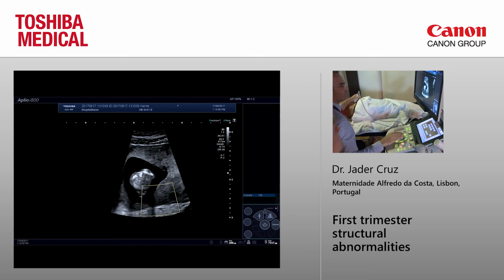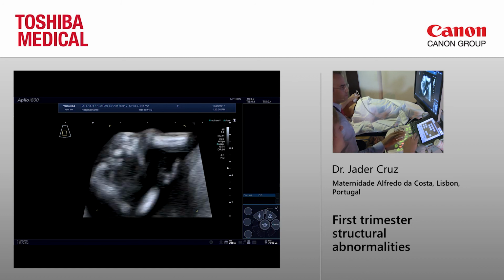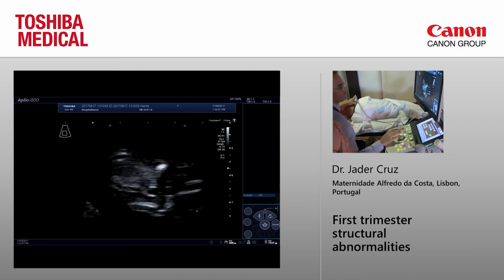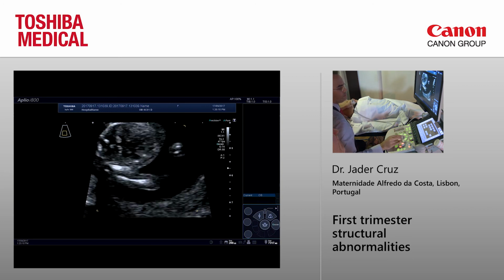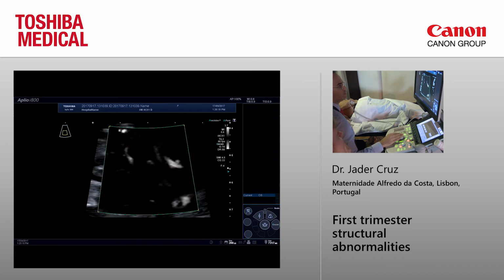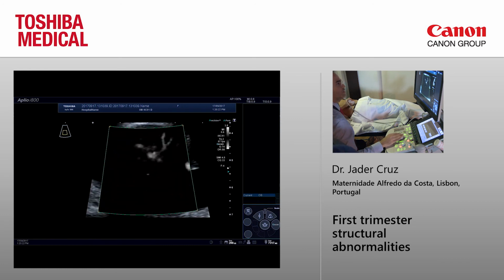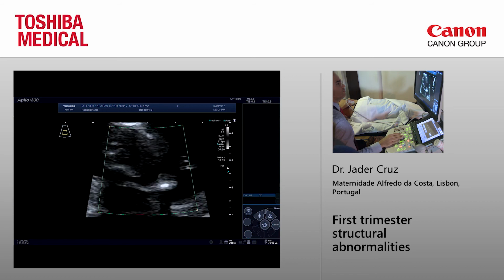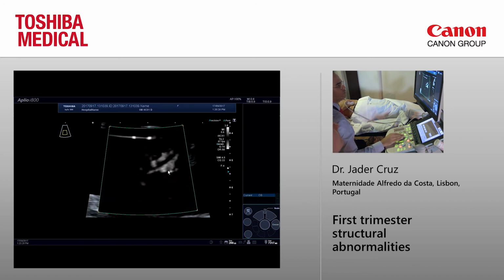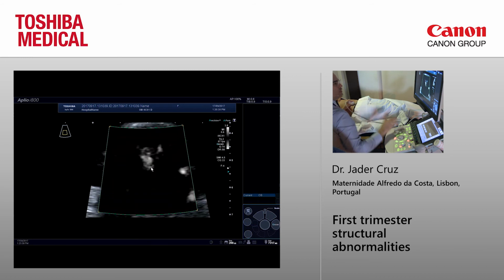Just want to show you if I can actually. Maybe I cannot. Maybe now, I'll try to show you the pulmonary artery, but it's not really a good setting or position for that. Yeah, we have the pulmonary artery there. You see the pulmonary artery, you see the aorta, a little bit of superior vena cava. I would be glad if the baby could turn around a little bit, but yeah.